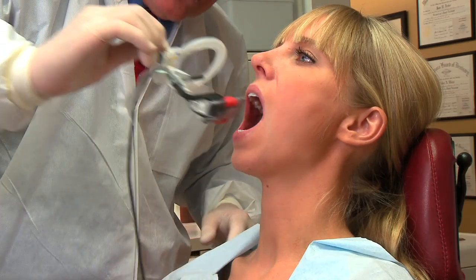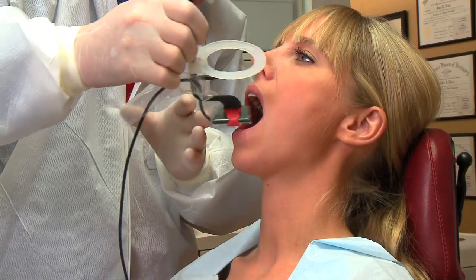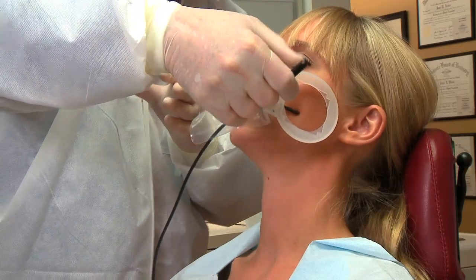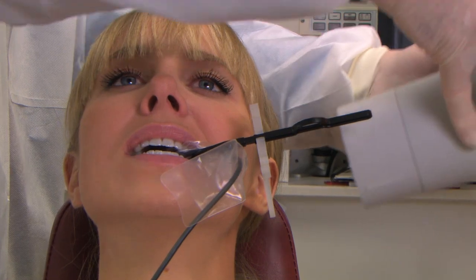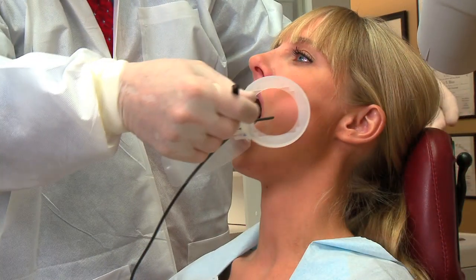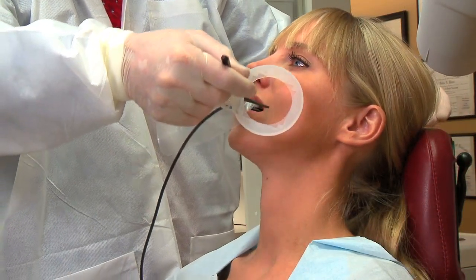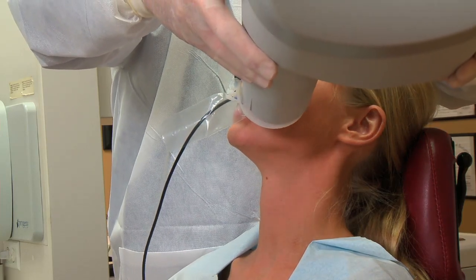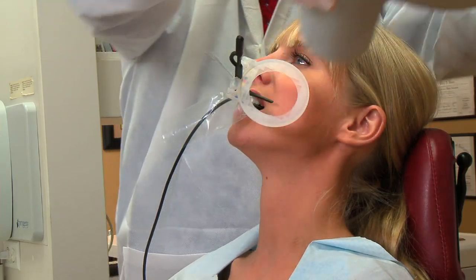Flip the holder for the other side and follow the same procedure. Go in at a 45-degree angle, turn, push, and close. Position the cone and take the image. Slide forward for the premolar position, close, and capture. Now you have all four of your bitewing positions without any change at all in the holder setup.